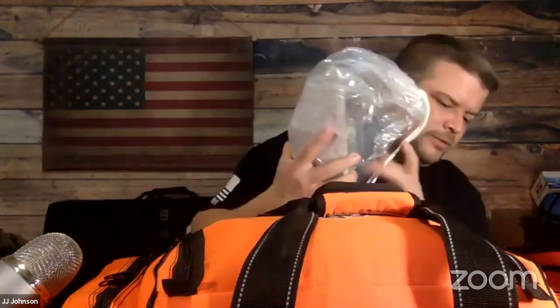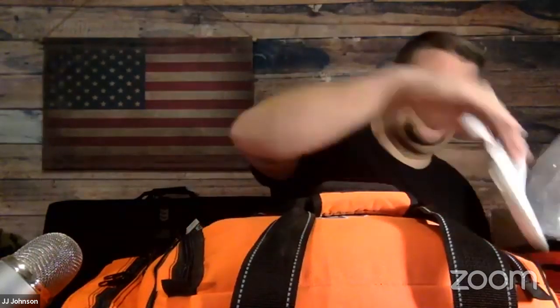And then we've got the big airbag for intubating. I don't know what it's called, but basically giving them oxygen, breathing for someone. And then I just threw in a jolly tank just to be able to transport fluids, water, whatever the case may be. Figured it could probably be used as an emergency bedpan kind of thing if you needed to. So there's those. Now we'll get into the main compartment. It's got the majority of the stuff in it.